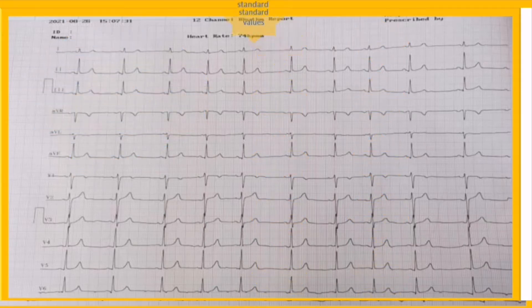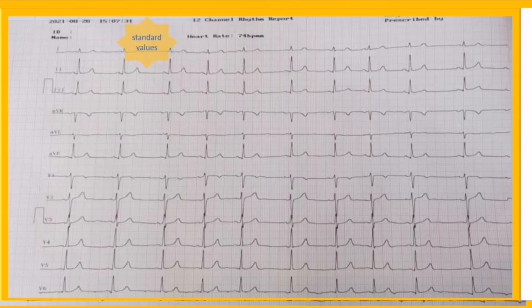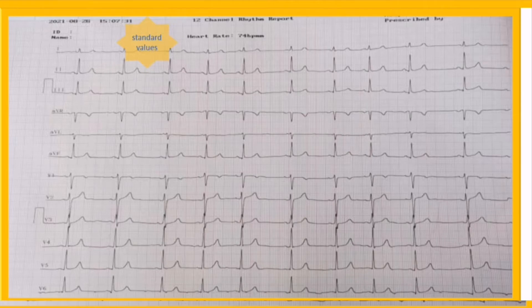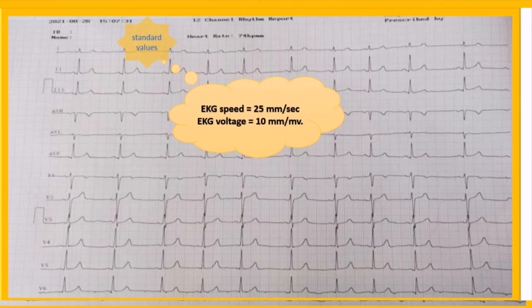The first step is standard values. Every EKG strip must be properly calibrated so that we can make a proper description of wave morphologies and intervals. Standard calibration values consist of EKG speed and voltage. The EKG speed is ordinarily 25 millimeters per second and the voltage is considered to be 10 millimeters per millivolt.